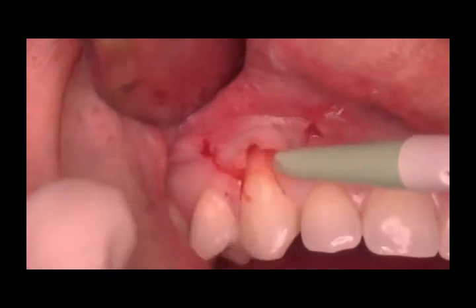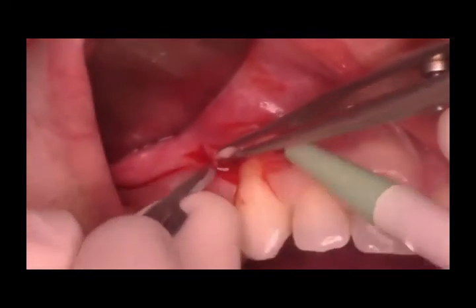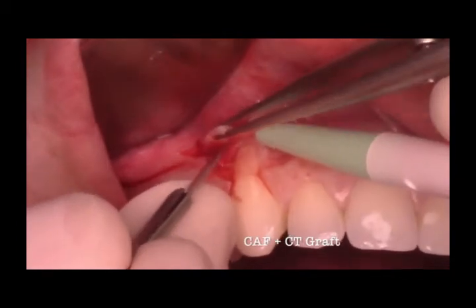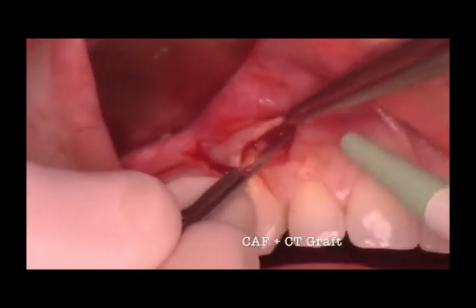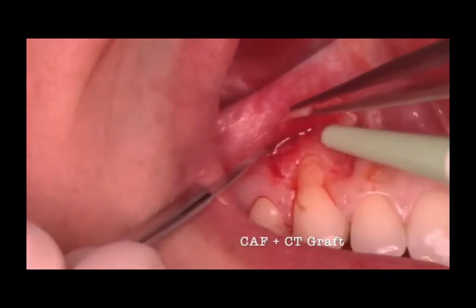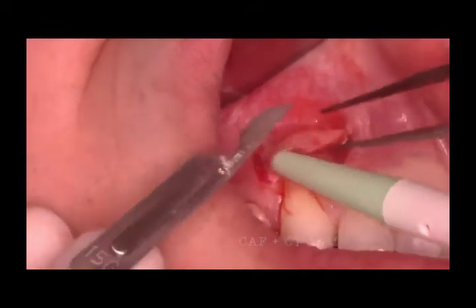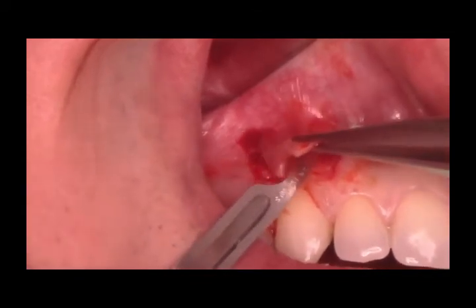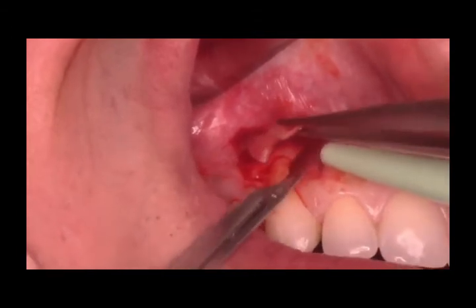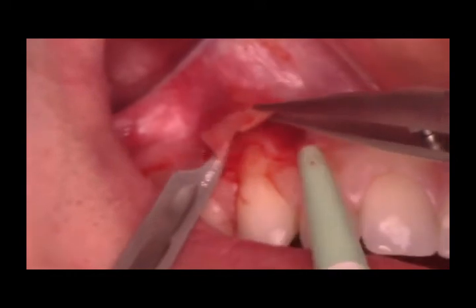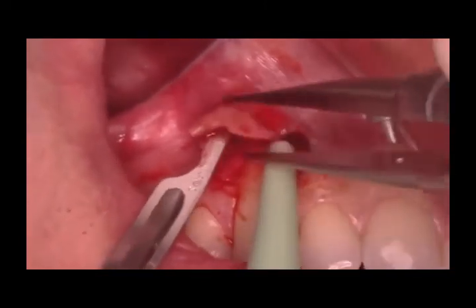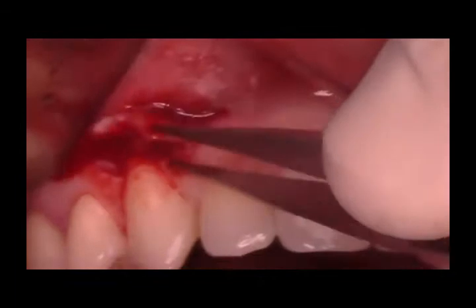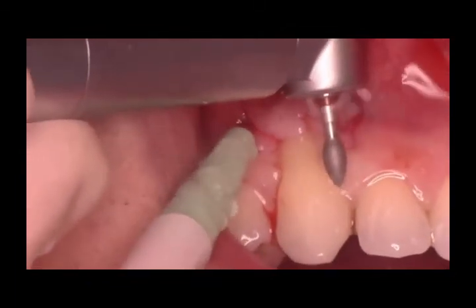The flap is mobilized up to its apical aspect with the help of various instruments. A full thickness mucoperiosteal flap is elevated to expose the underlying root surface and also the bone.